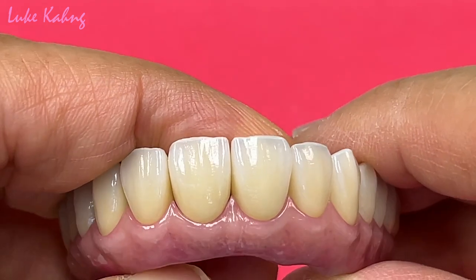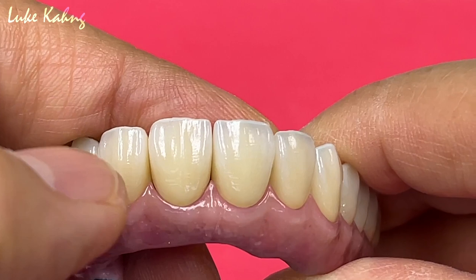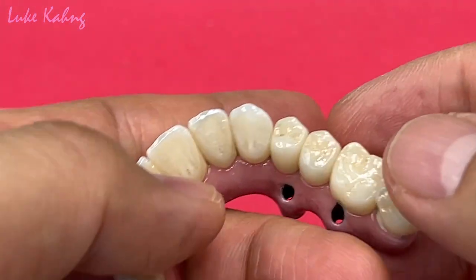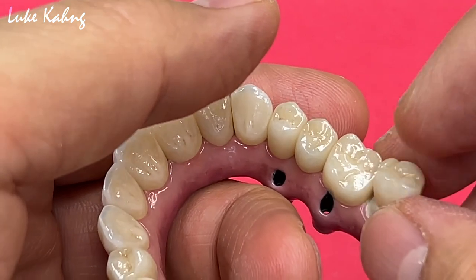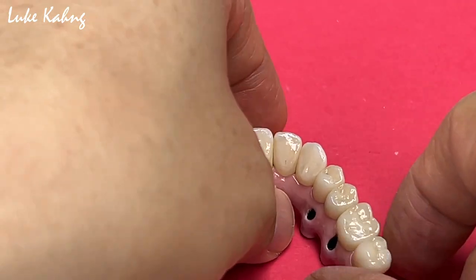Excuse me. So we have to cement the central first, and the canine, and the lateral, and then the premolar and molar in turn. Okay. So that one is before we go to the final cementation.